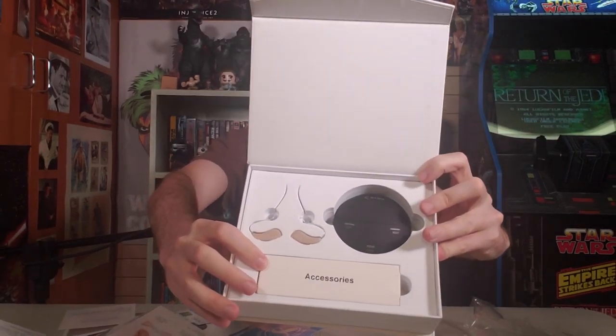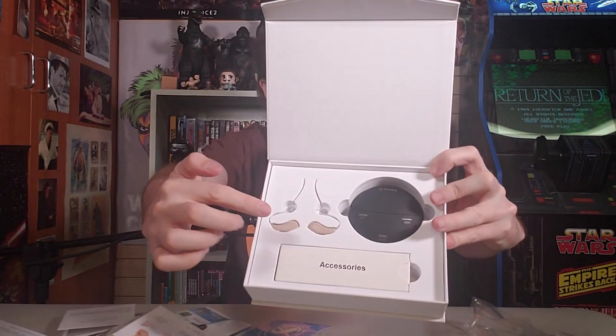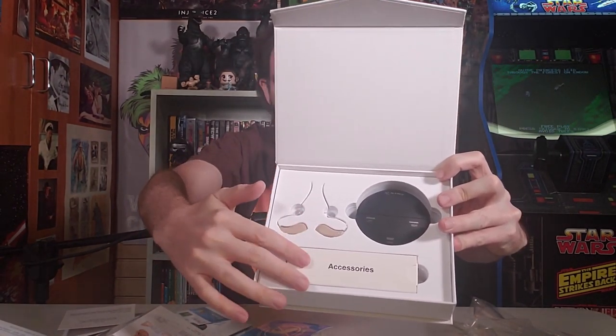Here is the meat and potatoes of what we're looking at. There's the case here, here are the hearing aids, and then there's something else — maybe accessories. Let's look at the hearing aids themselves first.